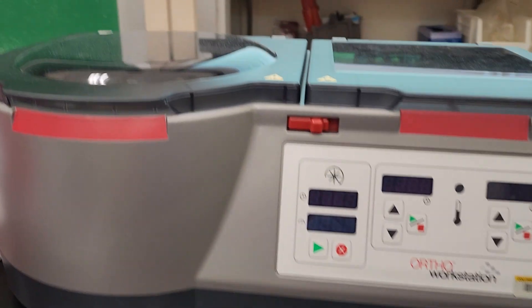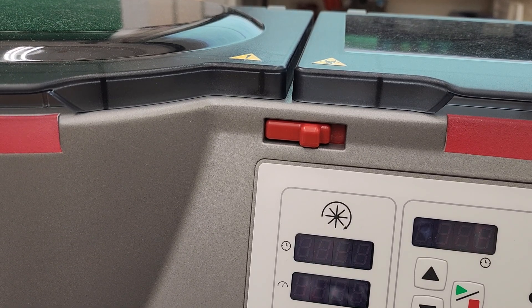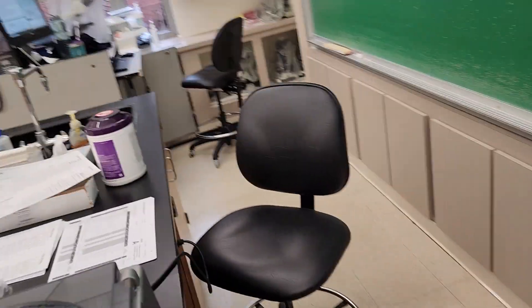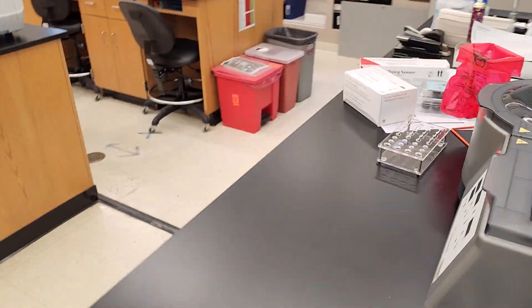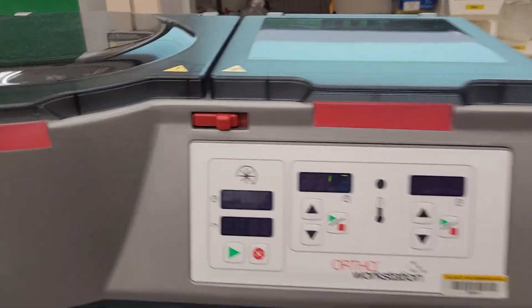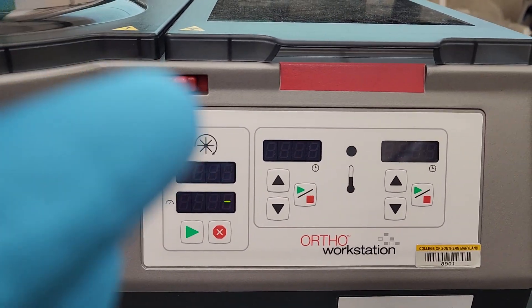The button is in the back. So the power button is in the back here. You flip that switch, and as soon as you do, you'll notice it'll start doing some loopy stuff.